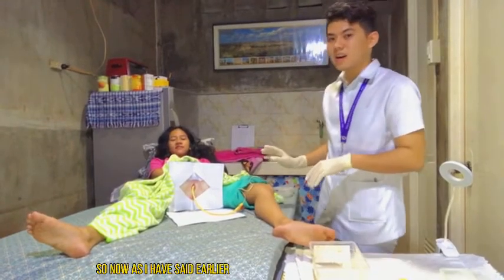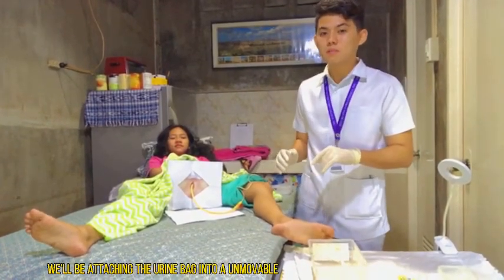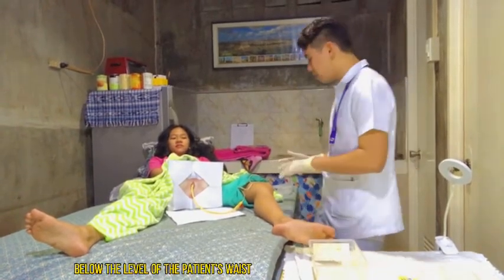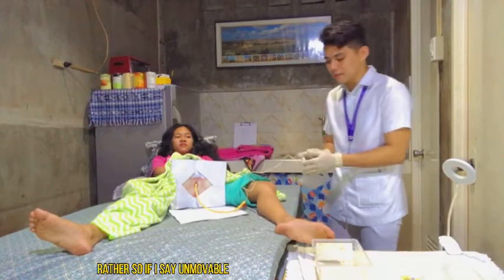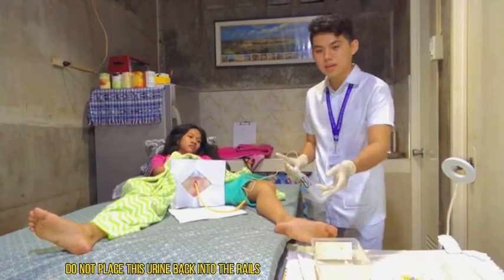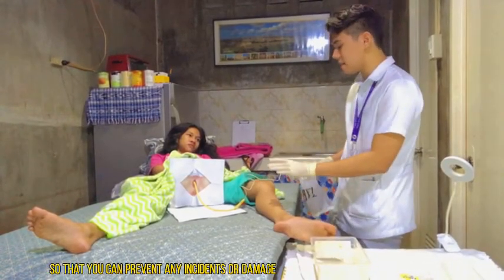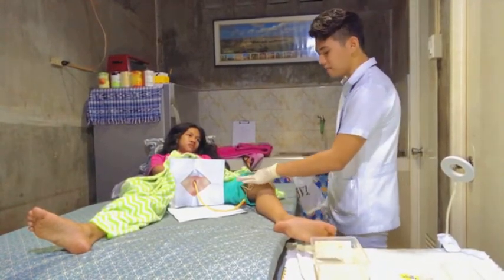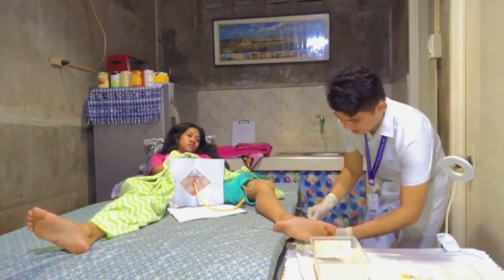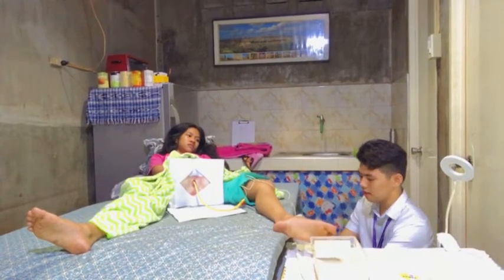So now, as I have said earlier, we'll be attaching the urine bag to an unmovable part of the bed below the level of the patient's waist. So if I say unmovable, do not place this urine bag onto the rails which are movable, so that you can prevent any incidents or damage to the area here. Okay. So the patient's face.